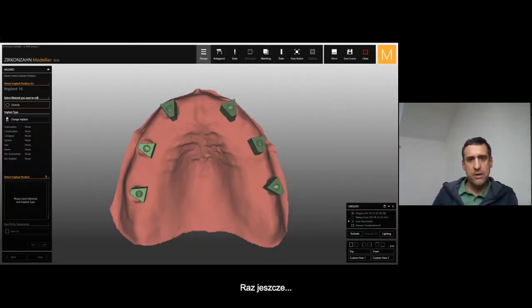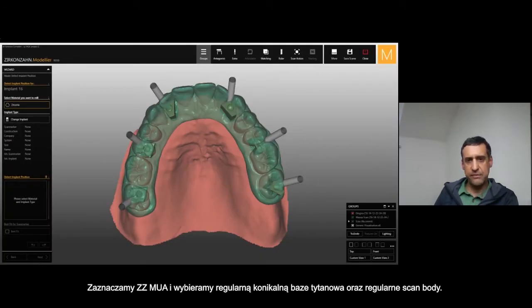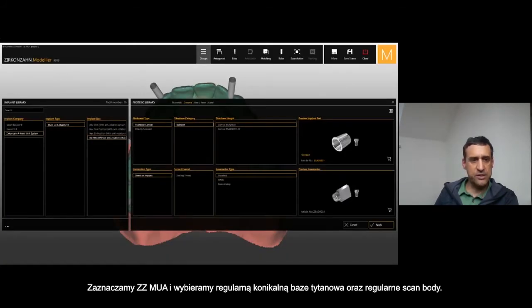Now we would like to see with a multi-unit 17-degree what is going on. Once again we have the same framework but with a multi-unit 17-degree. From this slide, you can see the inclination of the channel screw coming out from the implant connection and the position of the multi-unit 17-degree angulated.